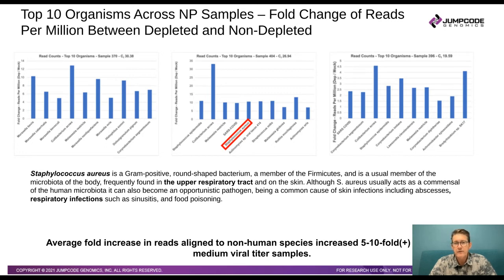And so if someone were to potentially present with a fever or other types of problems or sickness that could be thought of as COVID, in this case it might have been found that it could have been due to Staph aureus. Obviously, this is a COVID positive sample, but I'm just trying to define an example here where, because we're able to identify the other organisms in these samples, this is a very good way to uncover co-infection organisms or unknown pathogens.